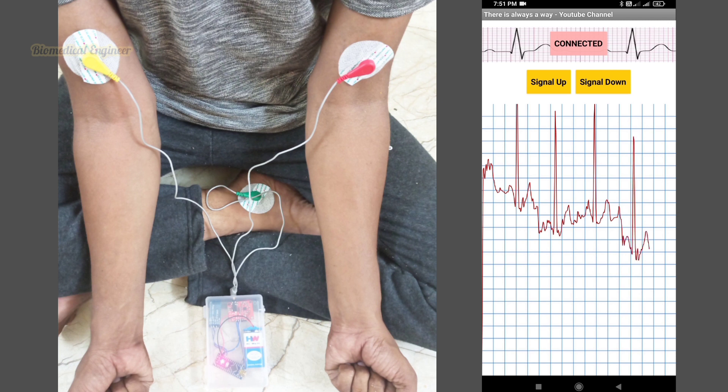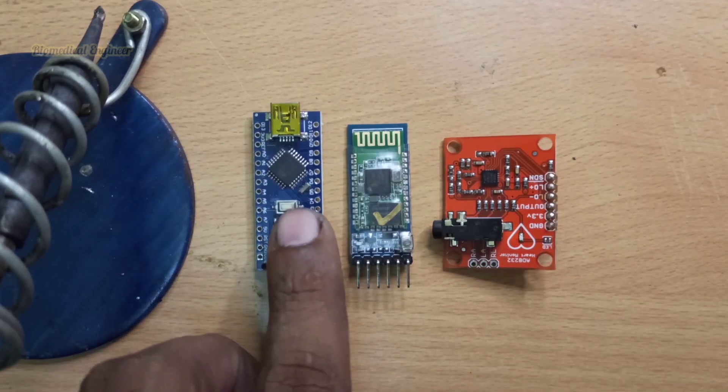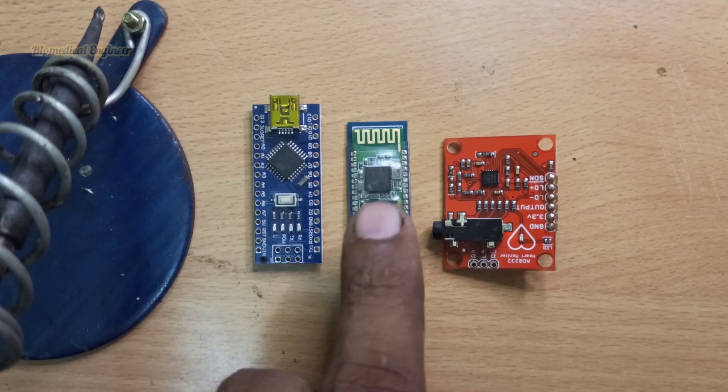Hi friends, I made this portable ECG machine and we can connect the ECG machine to our mobile application. This is the output I got in the mobile phone. To make this, we need an Arduino Nano and a Bluetooth module.